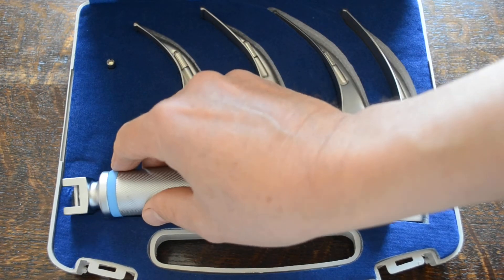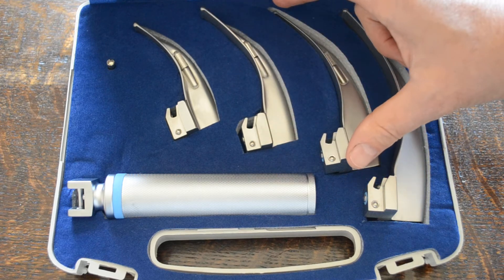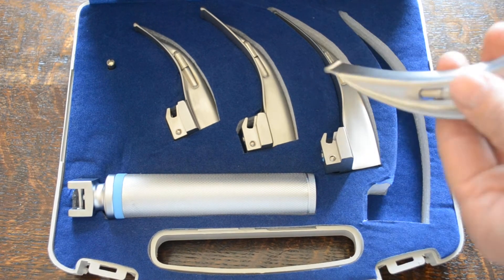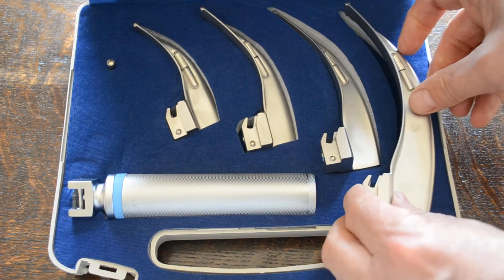The four standard blades are 9.5cm, 11cm, 14cm, and 16cm curved blades, made of quality aluminium steel. Very nice quality blades.